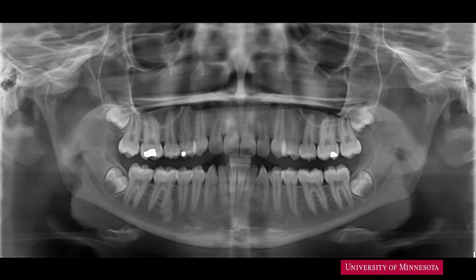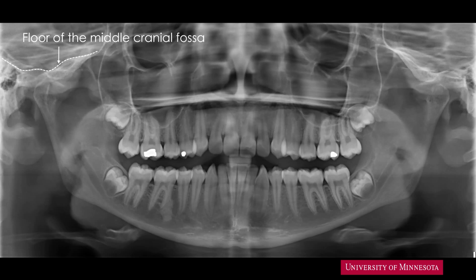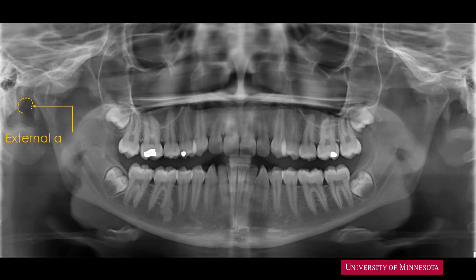Let's use another panoramic radiograph to identify a few more landmarks. Superior to the condyle is a thick, irregular radiopaque band — this is the floor of the middle cranial fossa. On the distal aspect of the condyle is a circular radiolucency — this radiolucency is the external auditory canal.